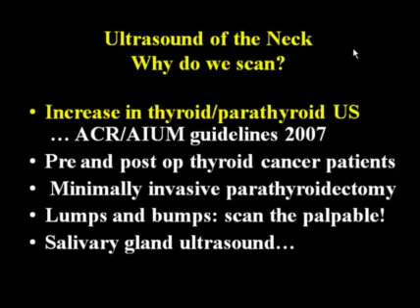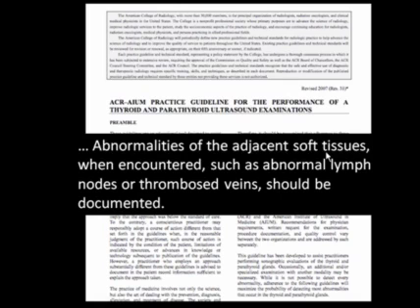Well, first of all, there's been a huge boom in imaging over the last 10 to 15 years, and we've seen an increase in the number of incidental thyroid lesions detected on PET CT scans, chest CT scans, cervical spine and neck CT scans and MRIs, and also patients undergoing carotid ultrasound for screening. So these patients have come to us for imaging to try to determine if these thyroid lesions are clinically relevant.